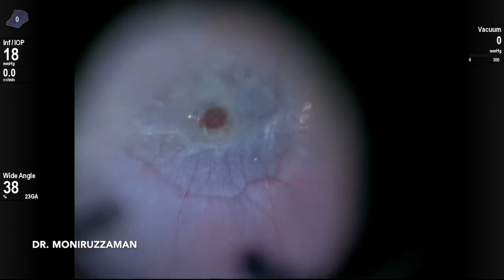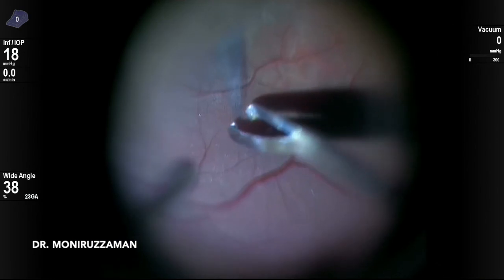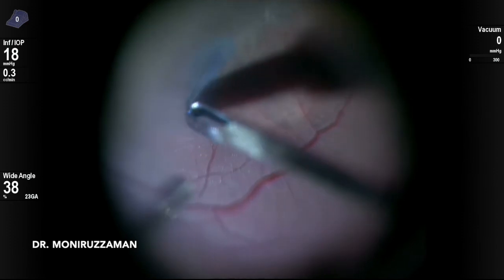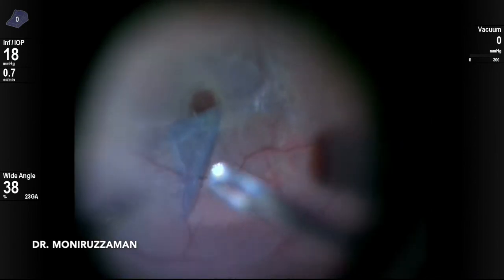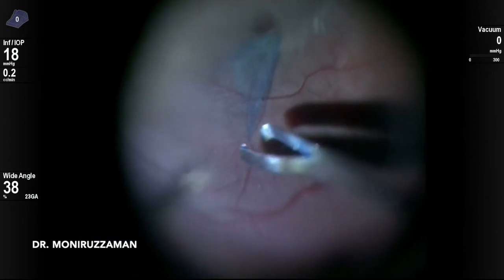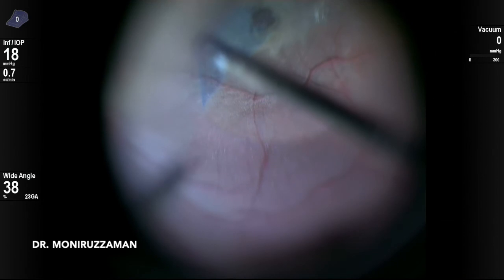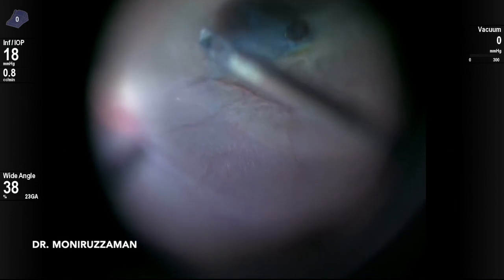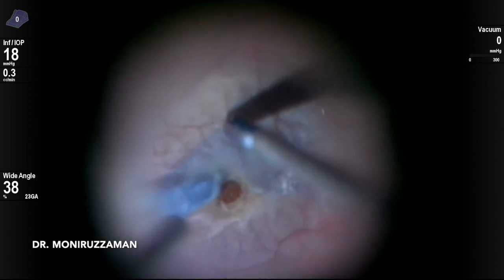This is another case of traumatic macular hole. It seemed there was a membrane, and it was thought it would come with ILM peeling. But during peeling, we found that a layer of sandy deposit is present under the ILM and the retinal layer, and the retinal layers had become distorted and fibrosed.